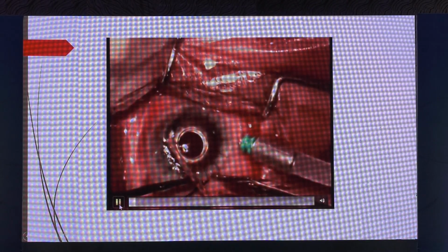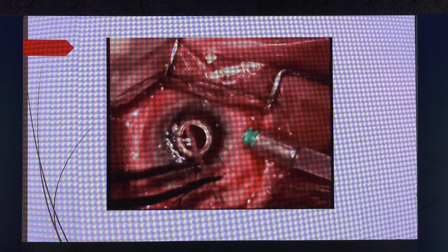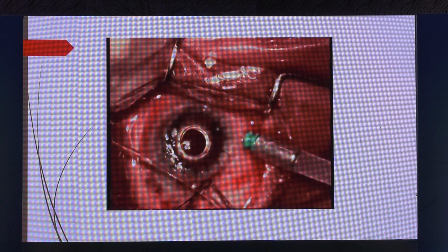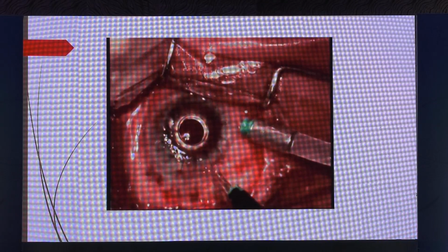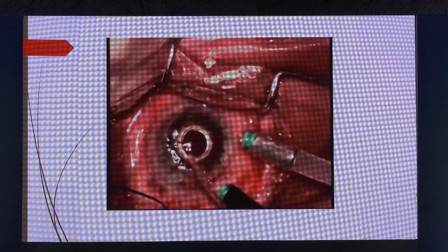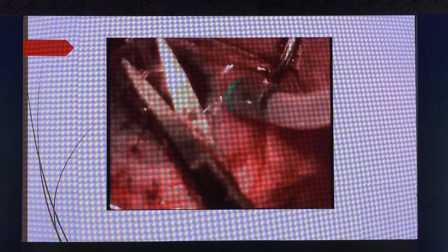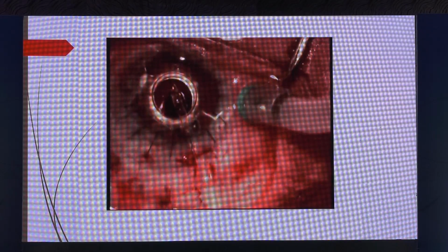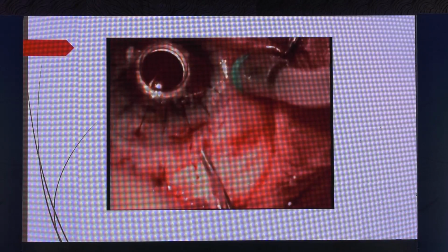And this is pars plana. So you can insert the tube in the pars plana also, especially in patients who have undergone VR surgery, or you can do it when you're performing a triple procedure with pars plana vitrectomy, because a complete vitrectomy is essential when you have decided to put the tube in the vitreous. So 3.5 millimeter away from the limbus, and cut the tube. Here the tube should be visible post-operatively through the pupillary area. So the length of the tube should be more, around 5 to 6 millimeter from the limbus.